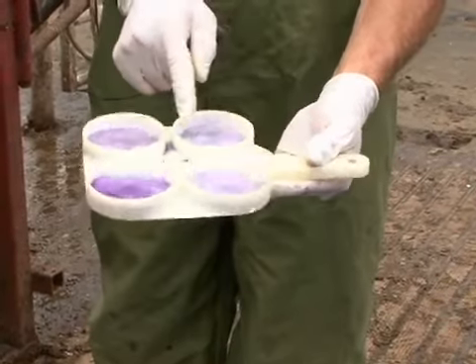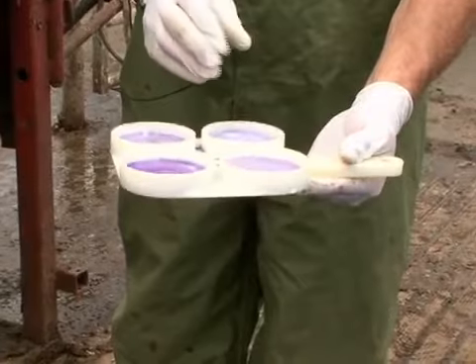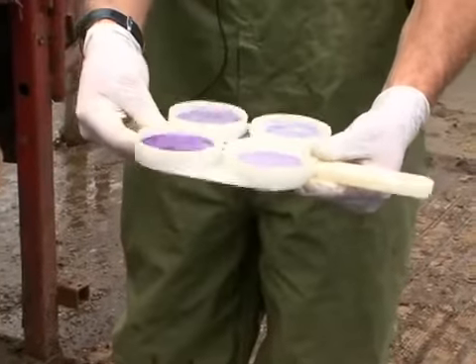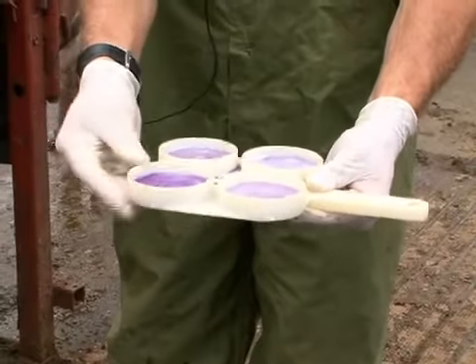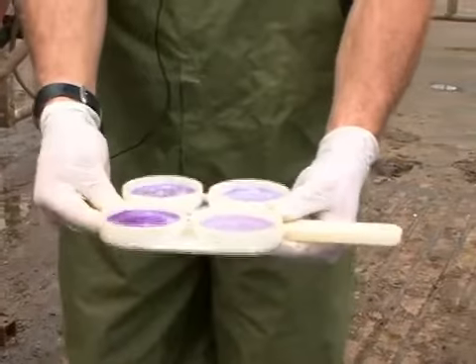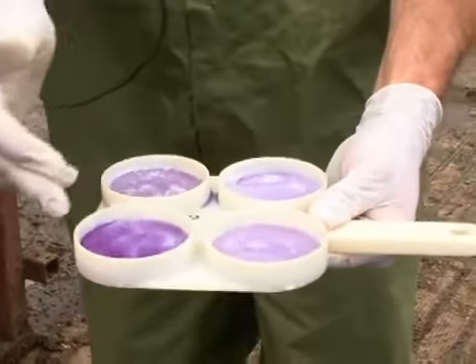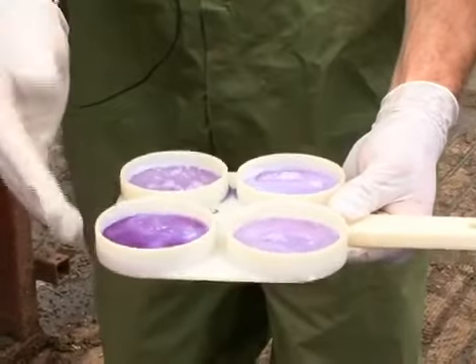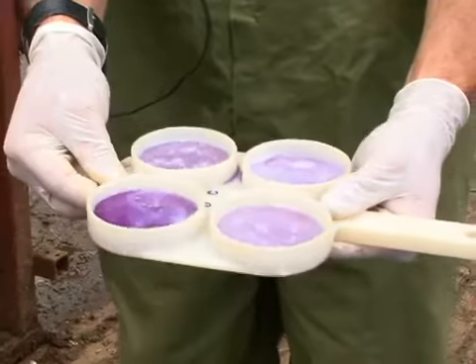And this one is a bit thicker and tends to be a bit more tacky and not so liquidy. But the most striking one in this result is actually her right hindquarter. You also notice that the color changed differently, again as a pH indicator. So she actually has a very severe amount or a very high level of white blood cells or somatic cells in this well right here.